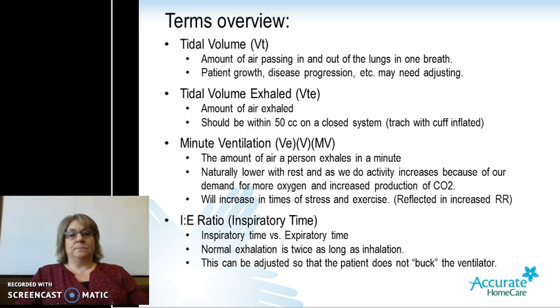Minute ventilation, or minute volume, is the amount of air a person exhales in a minute. It is actually a flow. It's naturally lower at rest, and as we do activity, it increases because of our demand for more oxygen and increased production of CO2. A person's minute ventilation will increase in times of stress, which is reflected in an increased respiratory rate.